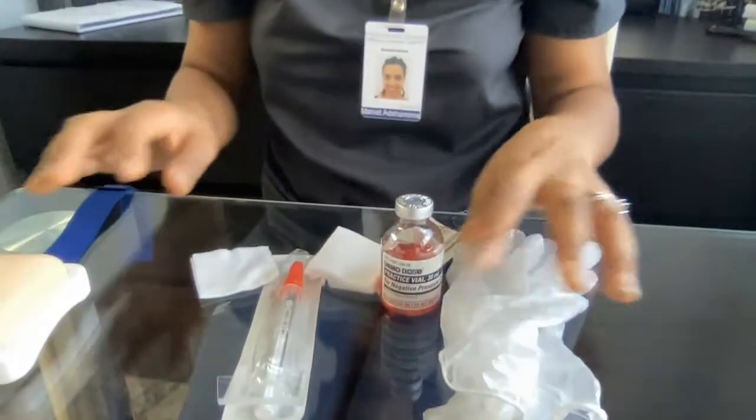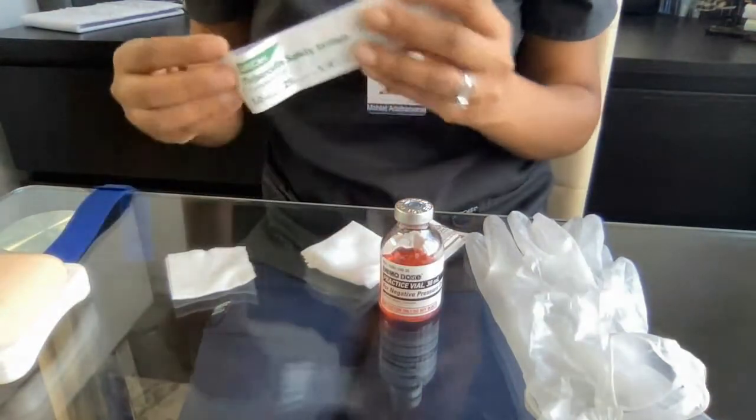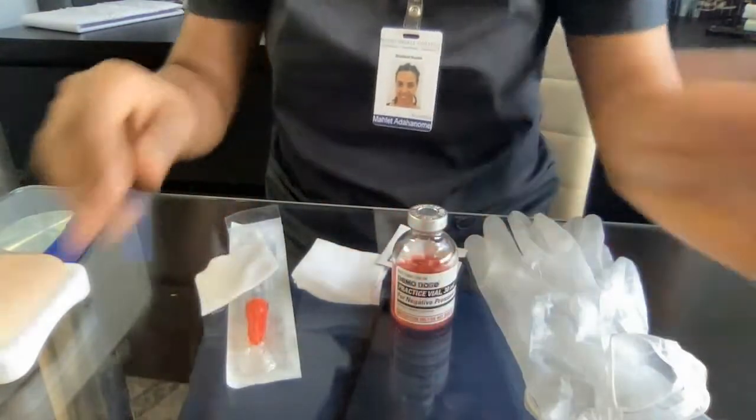Hi, my name is Mahalit and I will be showing you how to do a TB skin test. The first thing I do is gather my required materials: my gloves, my syringe, gauze, alcohol swab, and the vial I will be using.